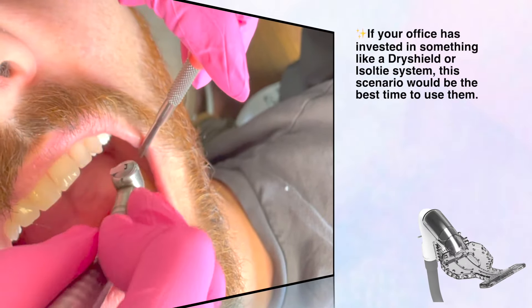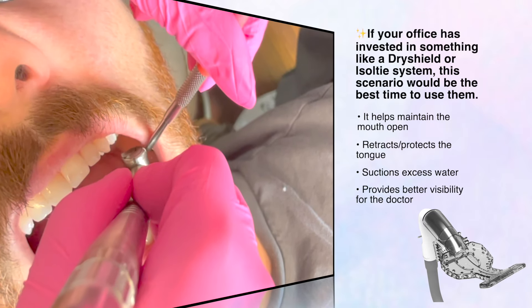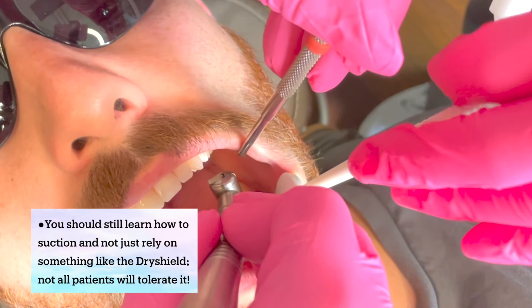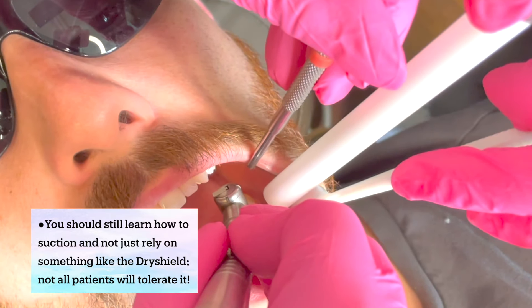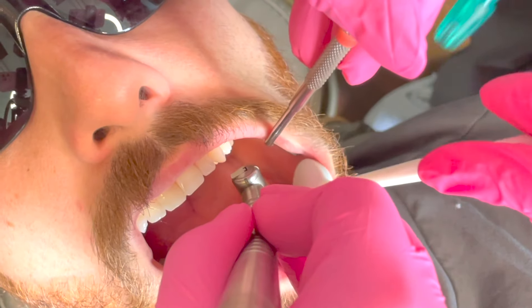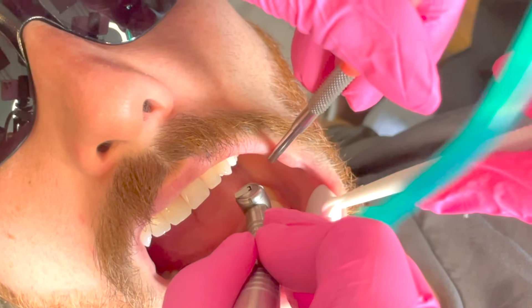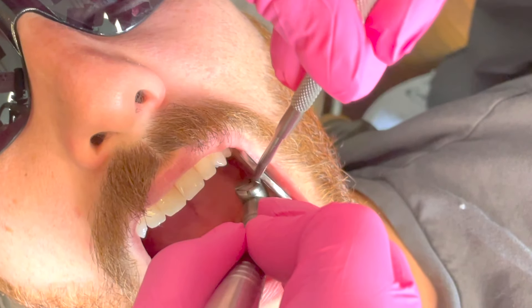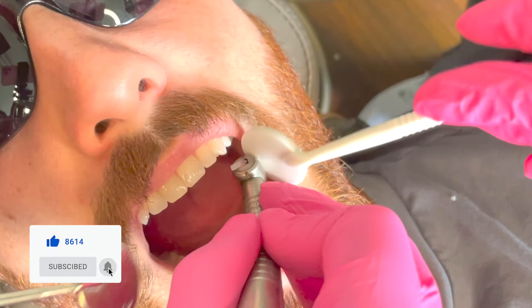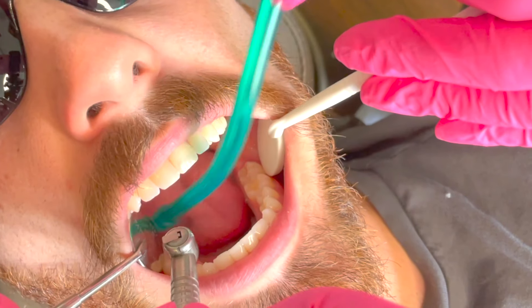Sometimes the doctor will just come right here — and it's like, who's retracting the tongue? It may be just a little second that they need to work. If you do have room to come towards the front, retract the lip and put your suction there. If you don't have room, use your saliva ejector and still try to retract the lip as much as you can. You also have to check on the patient — you might be getting all the water on one side but there's a puddle on the other side, so sometimes you have to go back and forth.